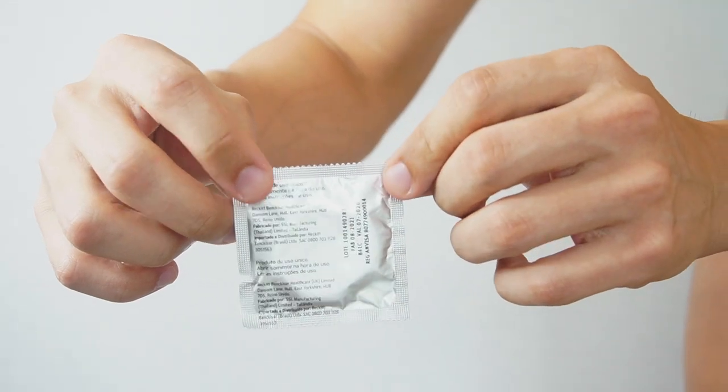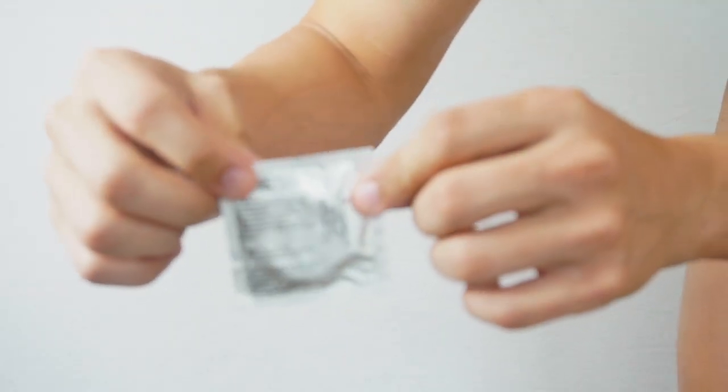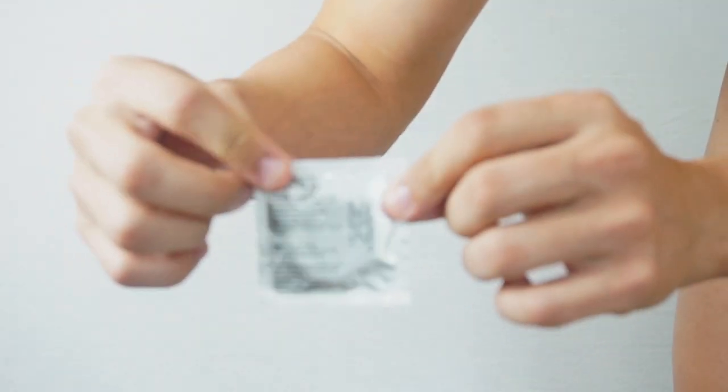Use your hands to carefully rip open the package by its corners. Never use scissors, your teeth, or anything pointy to open it, as you might rip the condom in the process.